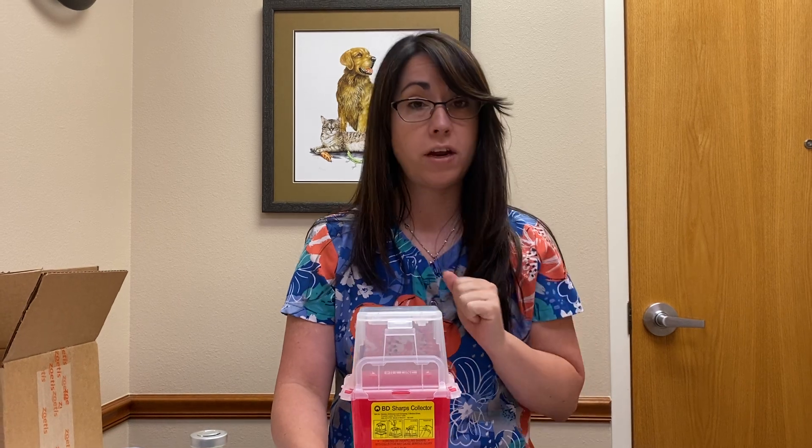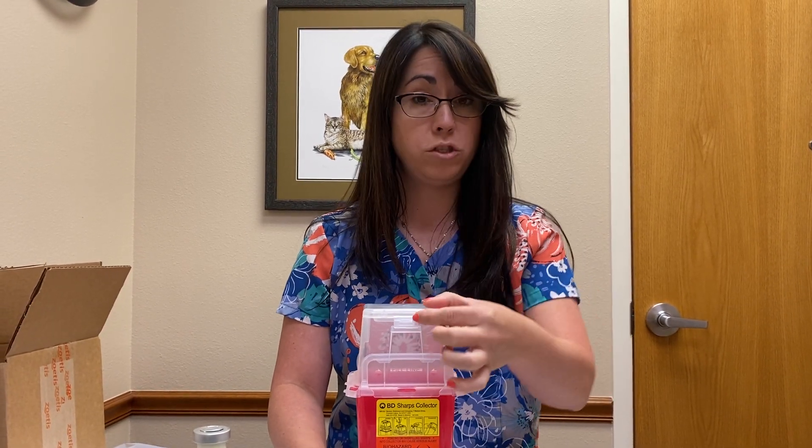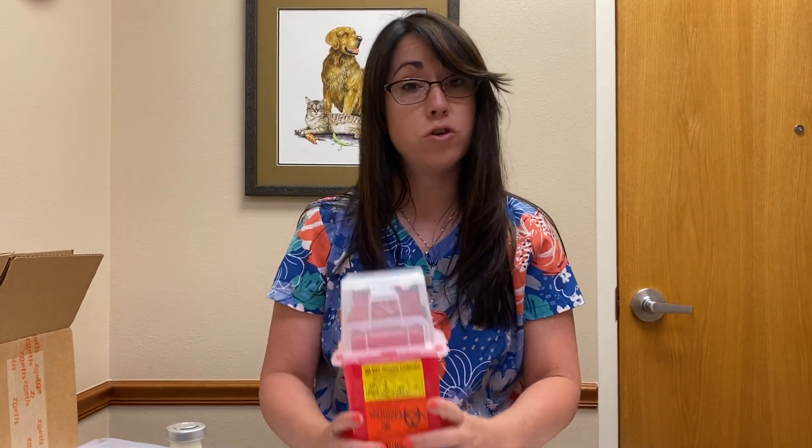When you close this, just shut it down. Do not close this little flap — don't tuck it in here, because once you've tucked it in, this thing is permanently closed. When you're done with these injections, you can take this to a firehouse and they'll be able to dispose of it for you.